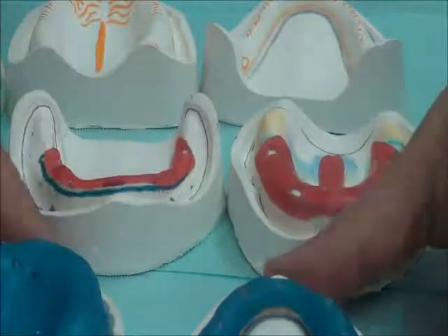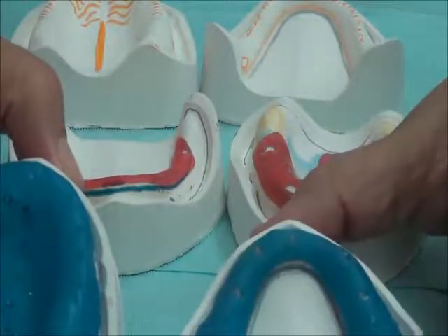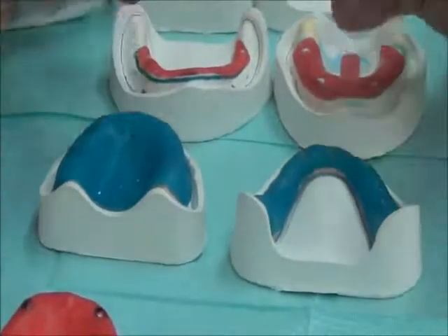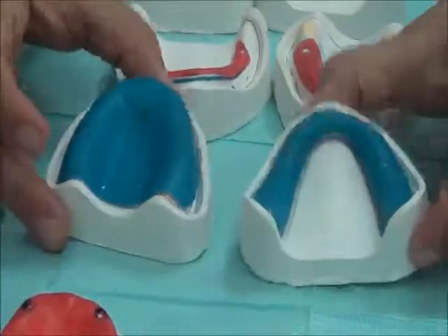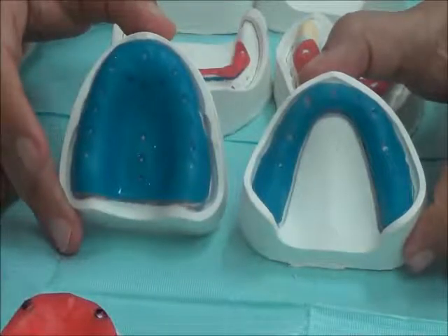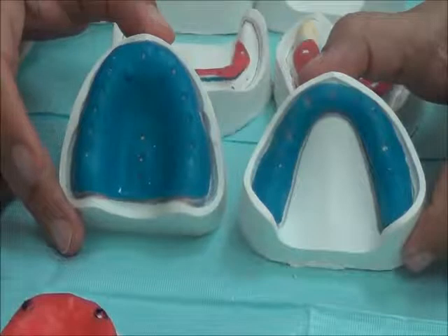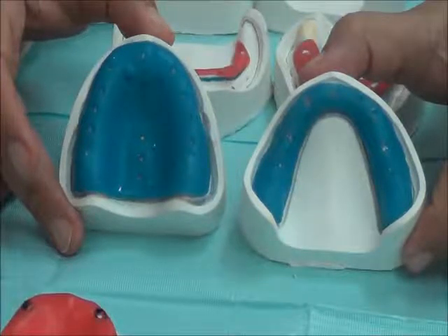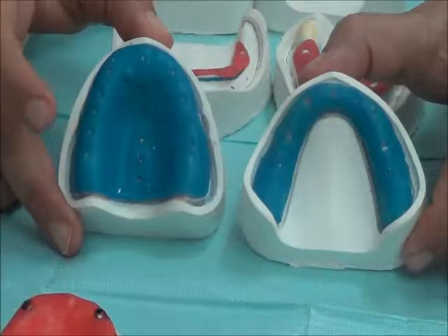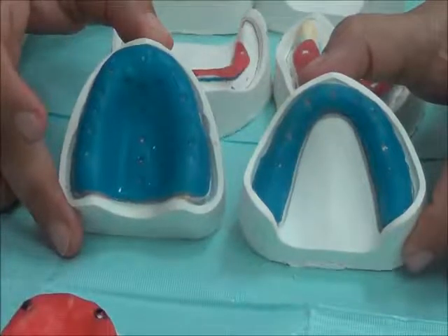Another method is to make a tray without any spacer. These are supposed to be completed as trays, but just to show you that in the areas where we want relief, we can place holes in the tray itself, the solid material. So even if a tray comes from the lab to you with no perforations and no spacers, you can add in the drilling of the holes by using a bur.